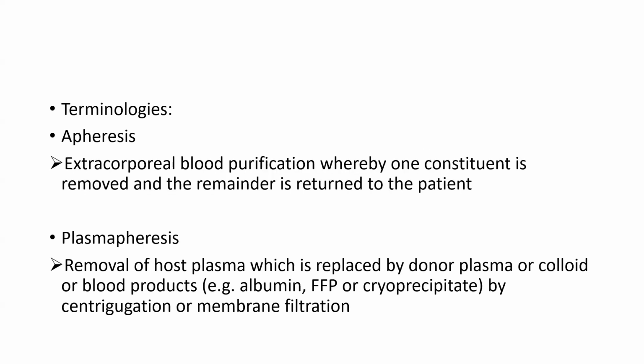So first we will understand what apheresis and plasmapheresis mean. Apheresis is extracorporeal blood purification where one constituent is removed and the remainder is returned to the patient. That means the substance which we want to remove, we are removing that only. But then what is plasmapheresis? Plasmapheresis is the removal of the host plasma, which is replaced by donor plasma, colloid, or blood products like albumin, FFP, cryo by either centrifugation or membrane filtration.